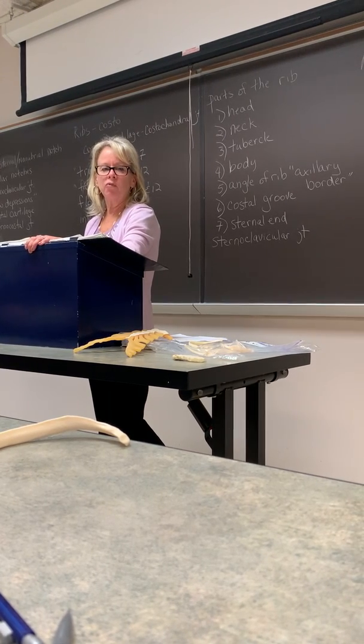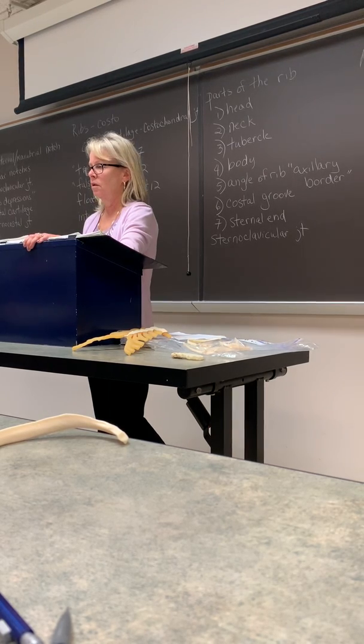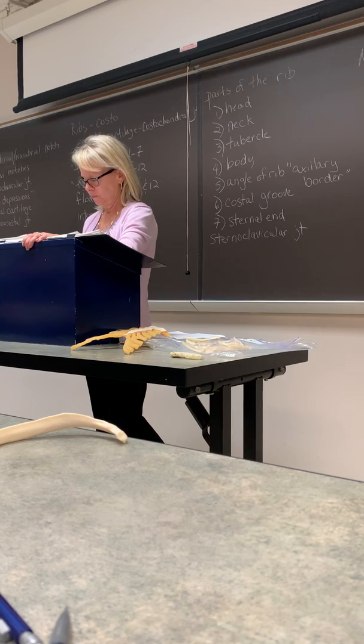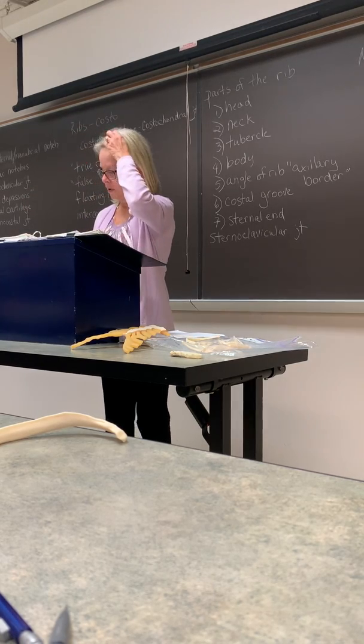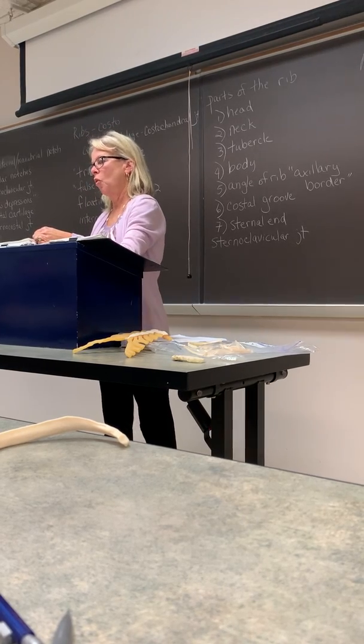Okay, for both of them, ribs and sternum, do them upright if you can. It's easier on the patient. You said 60 to 70 kVp? Yes. People that have rib and sternum injuries don't want to lay down.